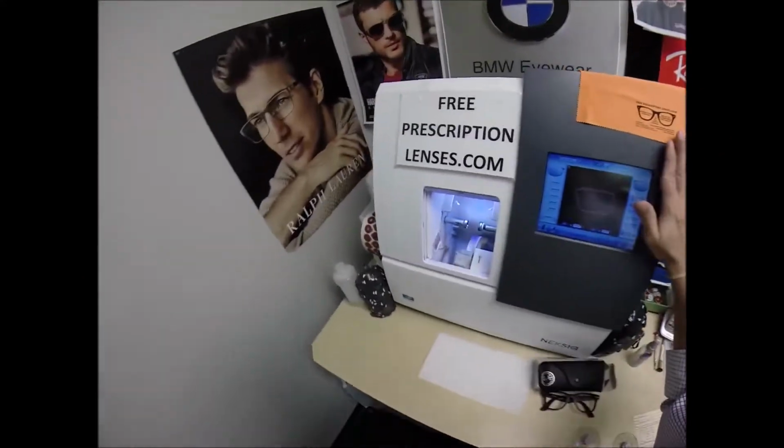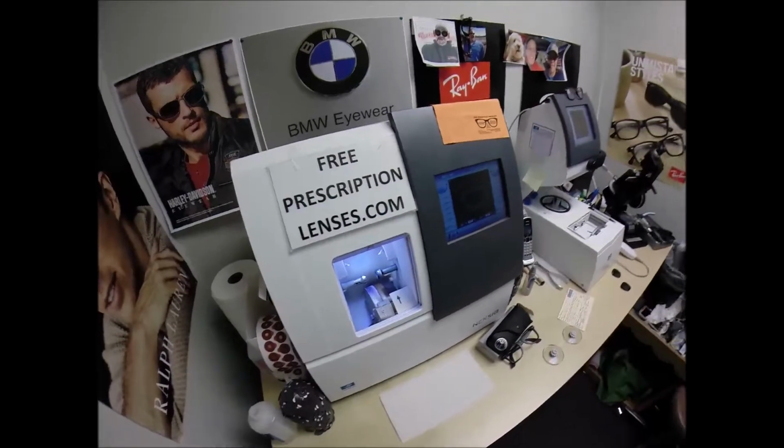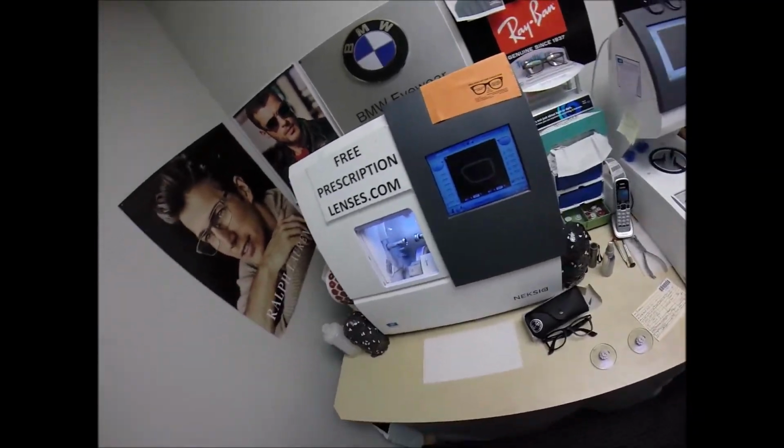The arm's going to come down, place a block onto the left lens. Now this is the edger. This is what's going to do all the work while I run my mouth. It costs $40,000. It weighs 200 pounds.